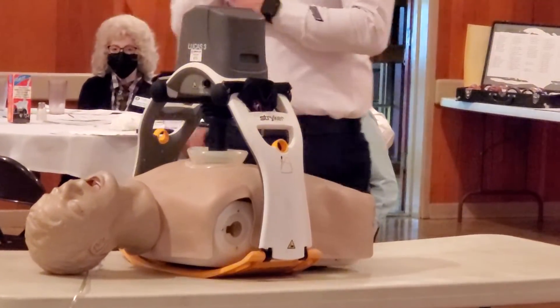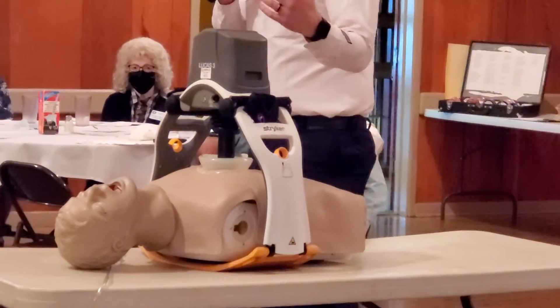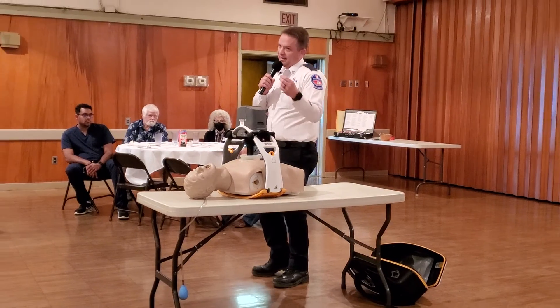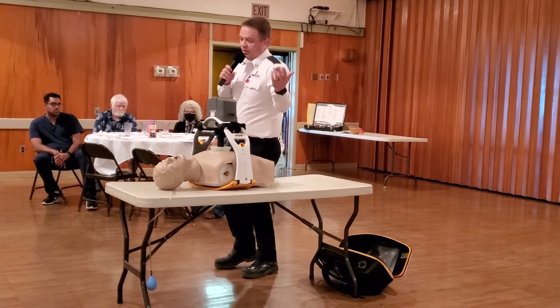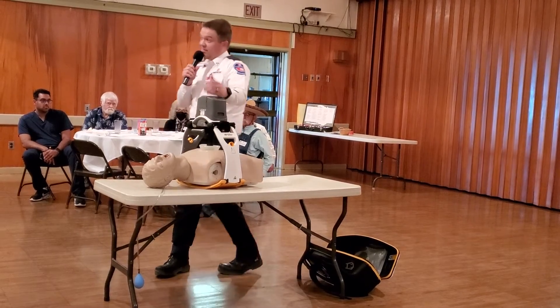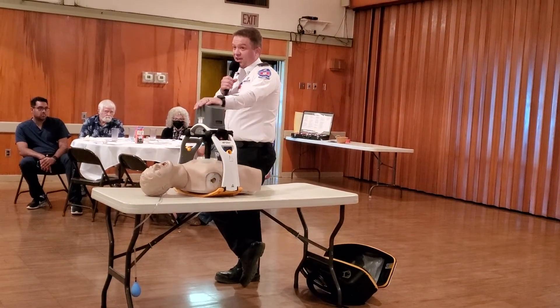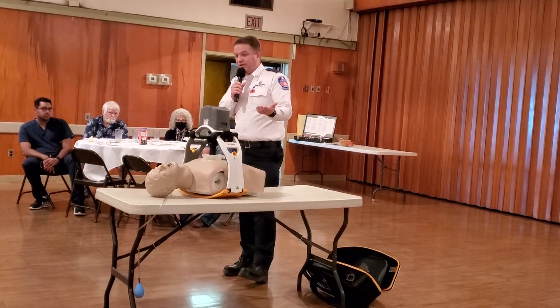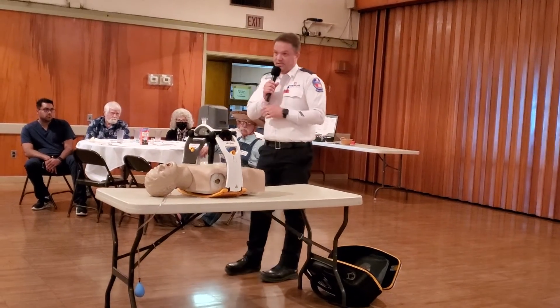The other mode is continuous. As soon as I place that advanced airway, I no longer need to stop, because I can deliver those respirations continuously once the tube is inserted. If I click play it's just going to go — I have done 45 minutes of care on the battery and still had time to go.